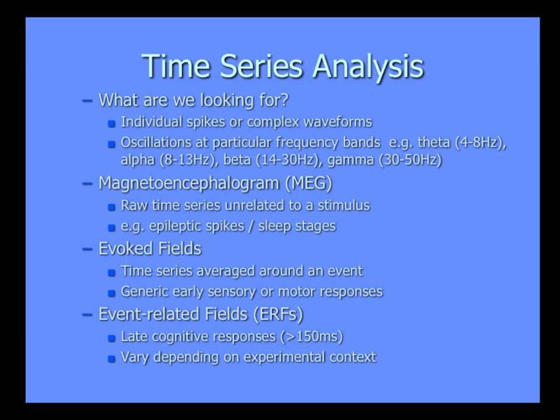These ones that are listed up here are the classic ones that are left over from many, many years of looking at EEG, the electrical activity of the brain, where they discovered that theta, alpha, beta, and gamma really reflected different processes. So by frequency filtering into those bands, you separate some of those processes, and it helps you to look at different functional aspects. Nowadays, we divide that up a little bit differently. One of the things that we're extremely interested in is high gamma, which is actually above 50 hertz. And there are differential notions about short range versus long range connectivity in the brain, and also feed forward and feedback, that have been suggested by a number of people, that are carried in different frequency bands.